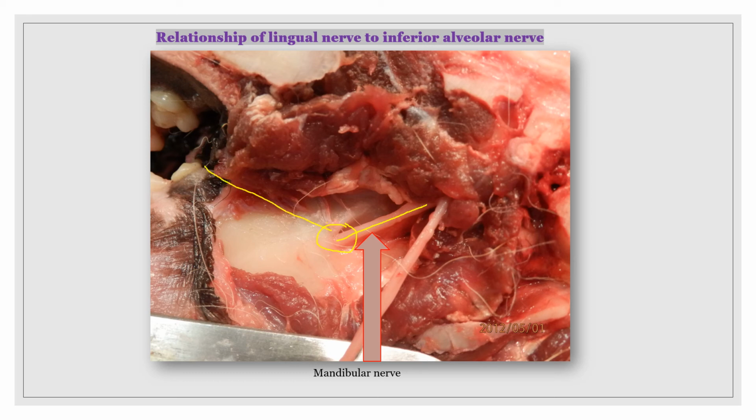So you can see that if you are not following along the bone here and you inject into this muscle here, number one, your anesthetic will not work because the muscle will hold the injection, and number two, you may also cause a hematoma in that muscle. And hematomas, we can see that occurs in people, and that can cause something called trismus. So the hematoma causes muscle pain, and so the patient has some muscle pain on opening and closing, which limits their amount of opening and closing. So that can last for a couple of weeks post caudal mandibular nerve block in humans.